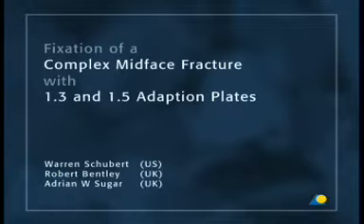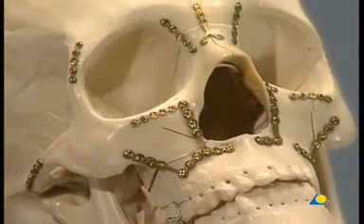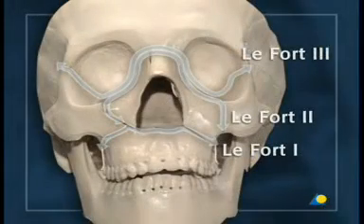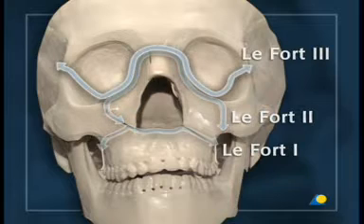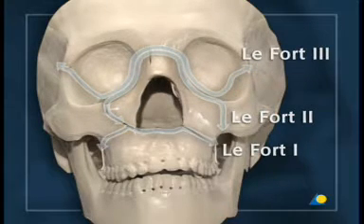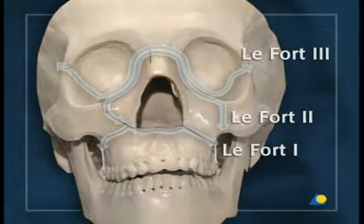This presentation will demonstrate the appropriate technique for the fixation of a complex mid-face fracture with 1.3 and 1.5 adaptation plates. The trauma has caused fractures at the LeFort 1, 2, and 3 levels, with bilateral avulsion of the zygomatic-maxillary complex and a multifragmental naso-orbital ethmoid fracture.